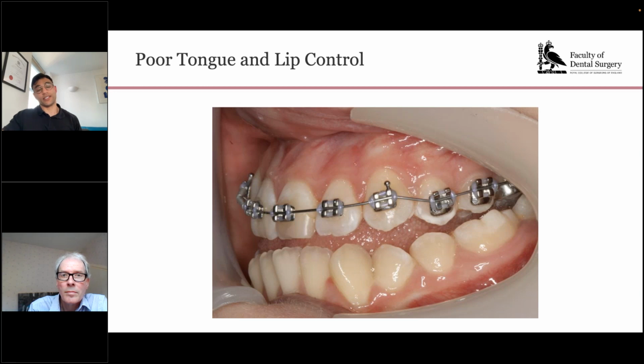So there's one of two ways, I guess, you could approach this, right? You could either have the conviction that you're going to take a sequence of photographs for every single patient, every time you see them, irrespective of the appointment or the nature of the appointment, and that is just what you do. And that's one way of solving that problem, and it's a very effective way of solving that problem. The other way to do it is to completely minimize the barriers to you taking a photograph in the clinic. And if that means having fewer moving parts, and that means having the assistant, irrespective of which assistant it is, being able to consistently assist you as effectively as possible, then that means doing that by having the simplest, most effective option.